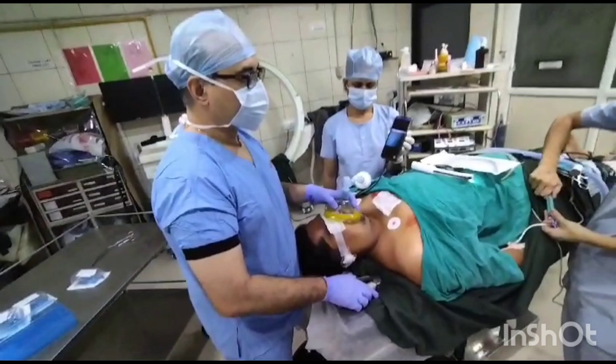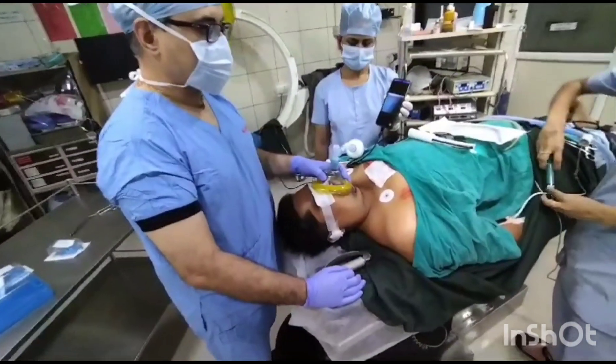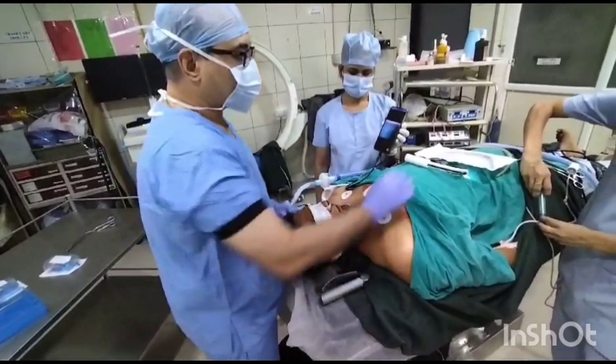So we are intubating with a TASCOPE. Propofol sedation is given to the patient. Preoxygenation is done. Suxamethonium is not given yet.